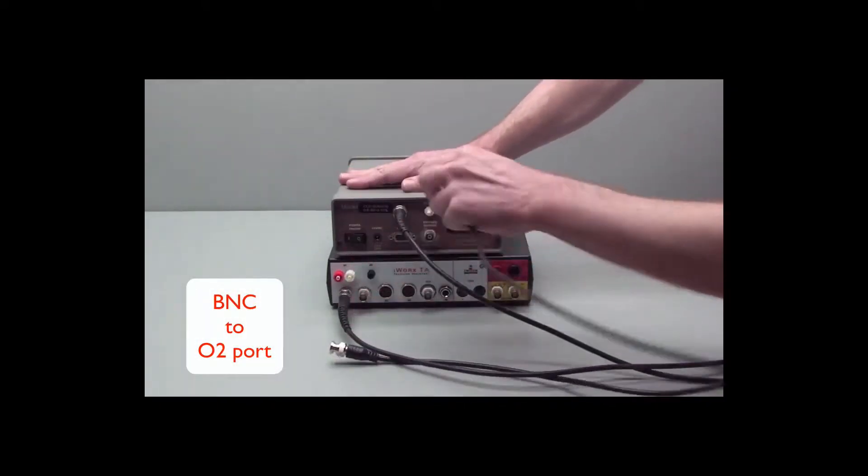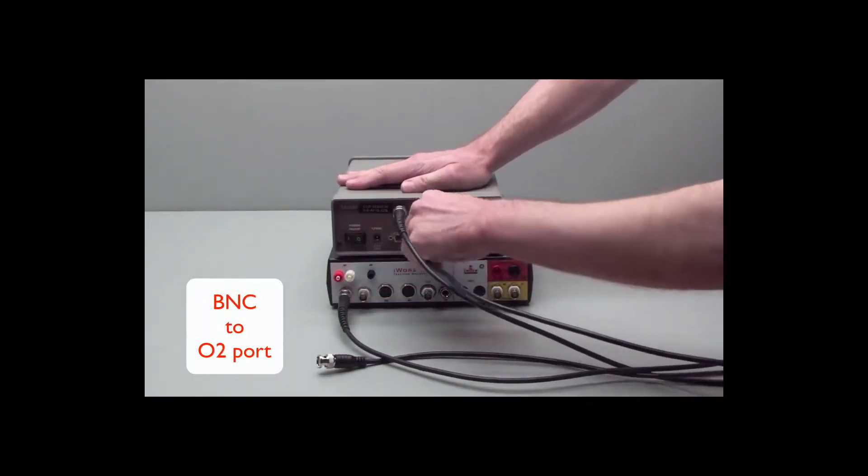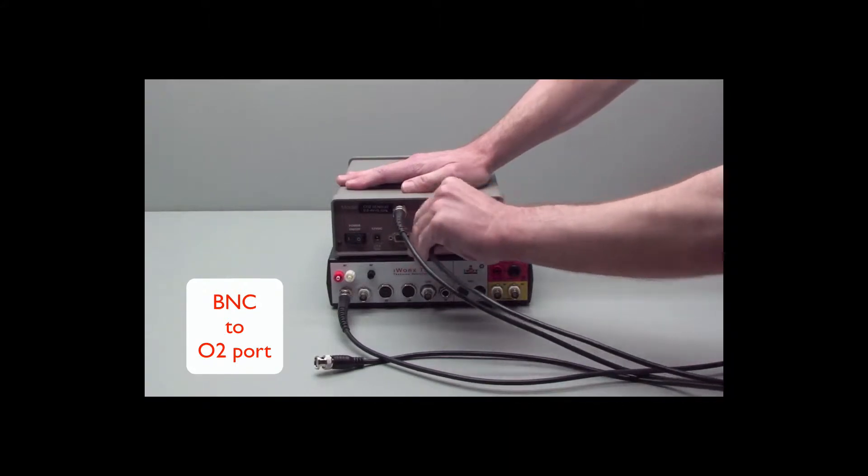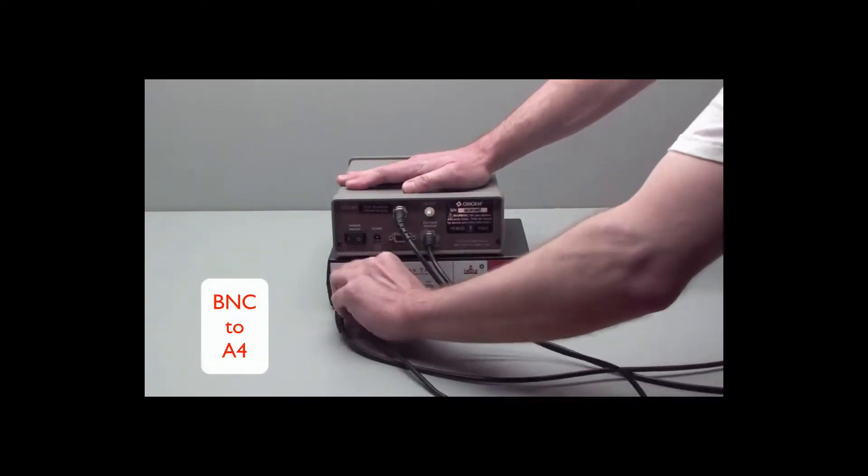Take the other BNC that goes to your O2 port, and the other end of it goes to channel A4 on the front of your TA.